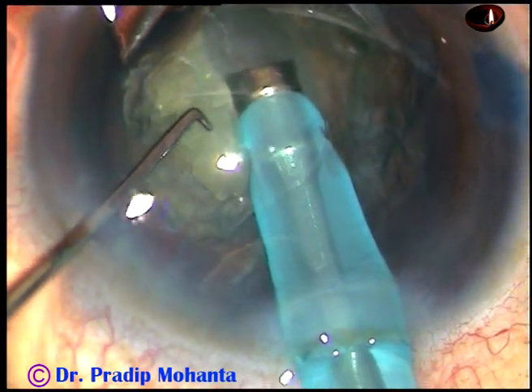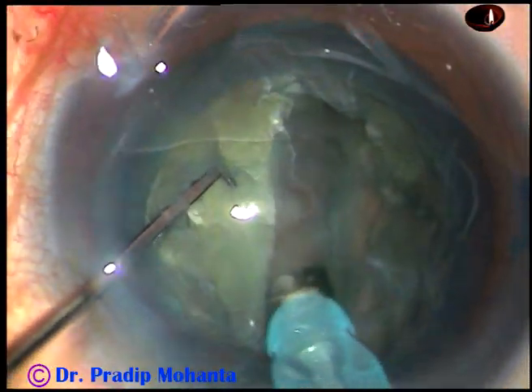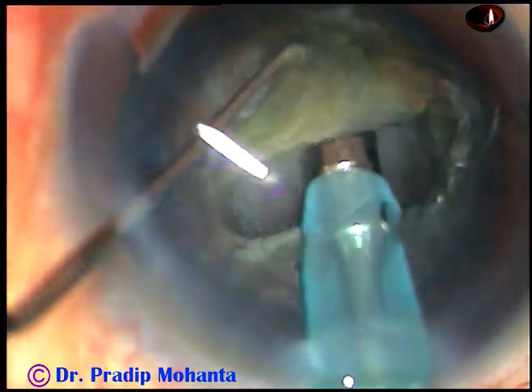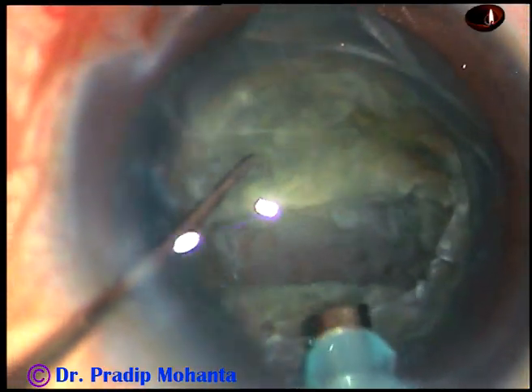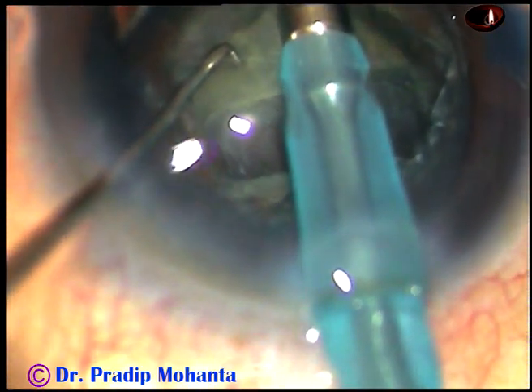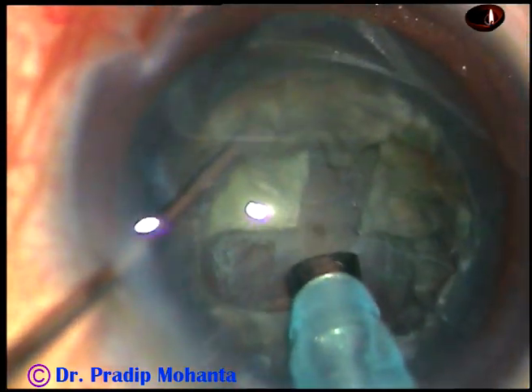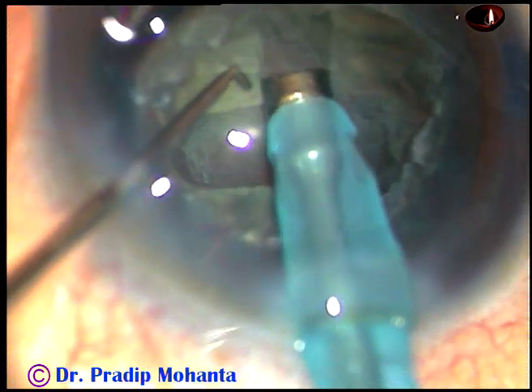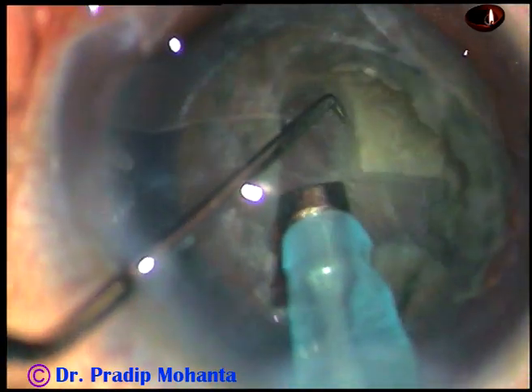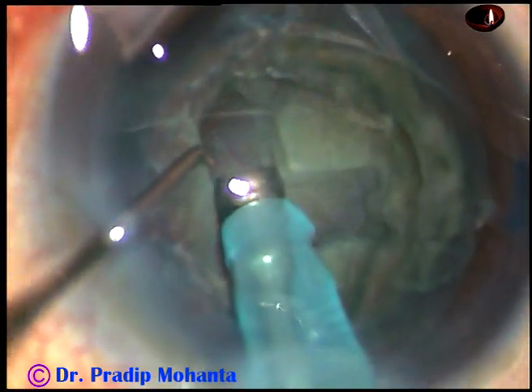Now start sculpting. At this time you don't need high vacuum. In this case the vacuum is only 50 mmHg, flow rate is 25, and the power is according to the hardness of the case. This is a softer nucleus — nucleus sclerosis is about grade 2 plus. So phaco power used in this case is about 50%. Now two trenches are being made.